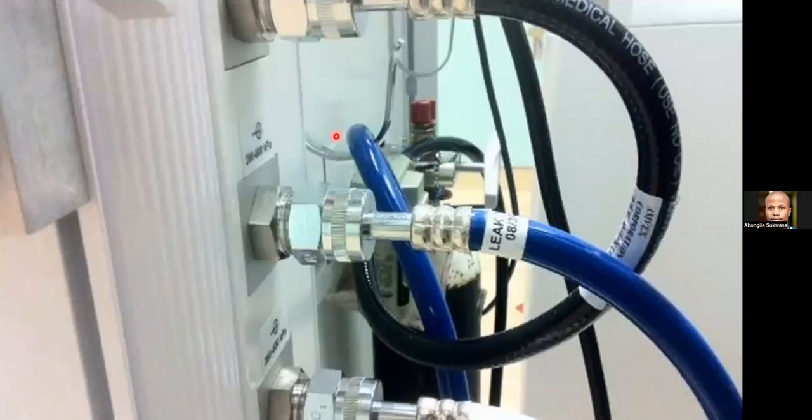As you can see, this is the back of an anesthetic machine. This is from the pipeline, so this is connected to the wall and also to the back of the machine. This is for nitrous because it's blue and it's a non-interchangeable screw system. And also at the wall level, there is the diameter index system and the shape index system.